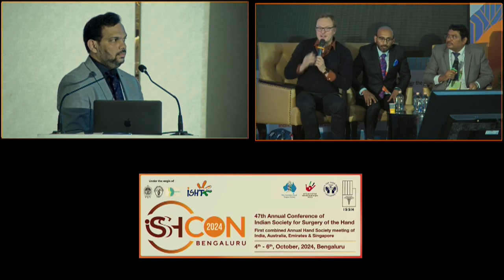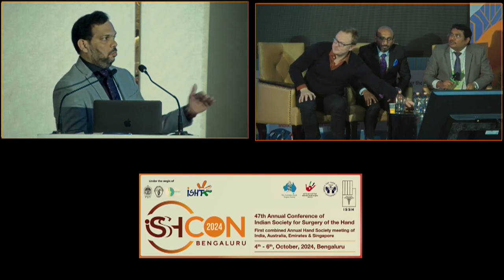I was just at ASSH Minneapolis, and there was a session about the big names of wrist arthroscopy, Lee Osterman, Paco Pinal, PC Ho, and so on. At least one or two actually said that they would not recommend doing arthroscopic wafer resection. I'm not sure what the problem is, but I usually struggle to get the same resection everywhere, especially on the dorsal side. I don't know if it's that I haven't been pushing with my thumb, as you said, so maybe I can solve the problem with that.